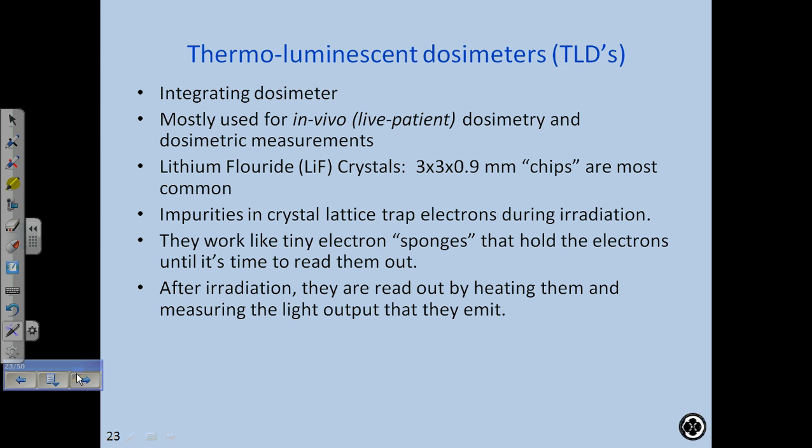The TLDs have been around for a really long time. There's all kinds of studies done, so we really understand how TLDs work. There's a lot of material for you guys to learn about. So TLDs are an integrating dosimeter.